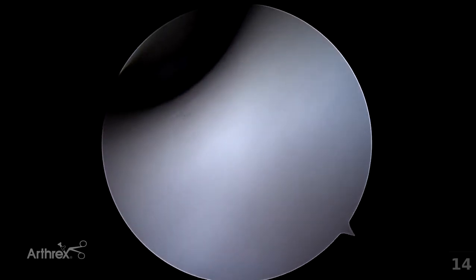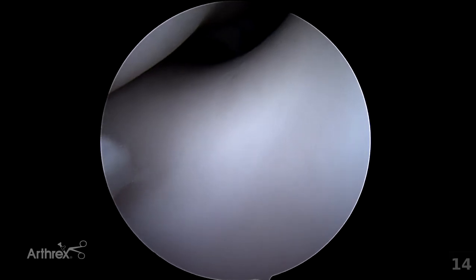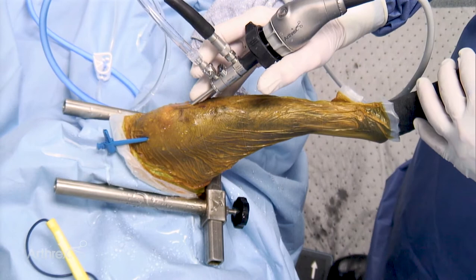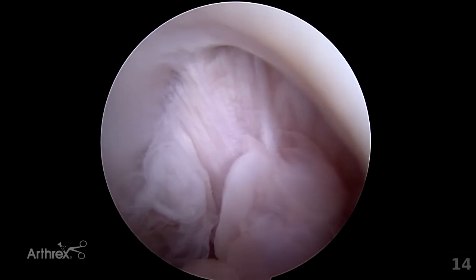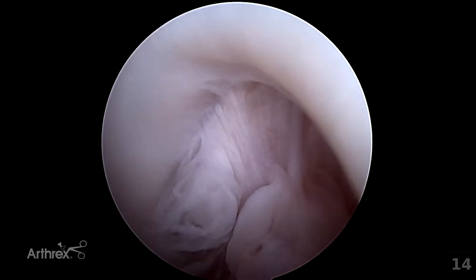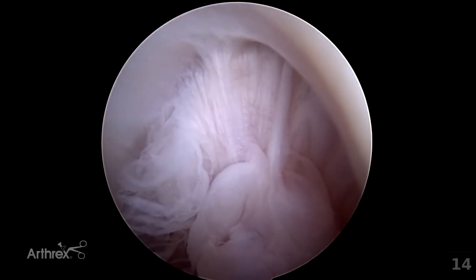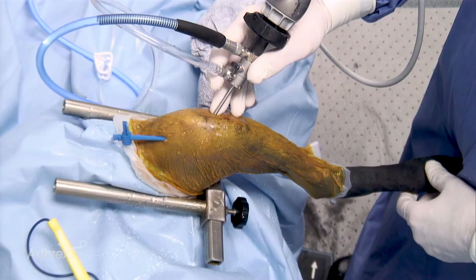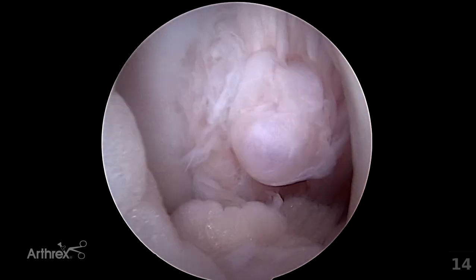Once the distal aspect is reached, the light post is maintained in a dorsal position so that one is looking ventrally with a 30-degree offset. The leg is then put into a slow and controlled flexion to allow entry into the notch. Visualised here is the notch. Changing focus at this point is appropriate to maximise visualisation. The intra-articular fat can be visualised ventrally. The origin of the caudal cruciate ligament is seen with associated synovial proliferation. Further flexion of the stifle will open up the notch and allow the fat to be more carefully seen.